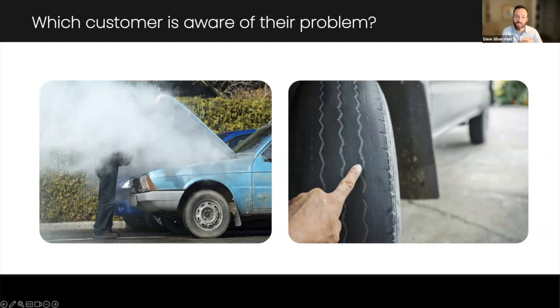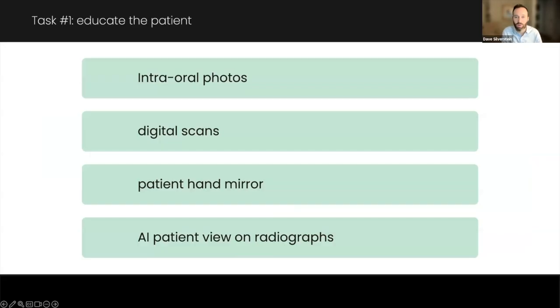The reason I showed this slide is that for the vast majority of our patients where we treatment plan Curodont, there are no symptoms. They don't realize that they have a problem. There's no pain or anything like that. So our first task is always, always, always to help the patient appreciate, hey, we've got a problem here. In my office, we do this by showing the patient. I never want to say something to my patient along the lines of, well, I can see it, or just take my word for it, or trust me. I'm like, no, no, no. Let's look at the scan together. Let's look at your x-ray together, right?